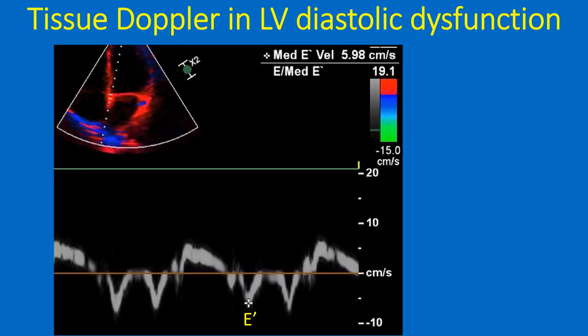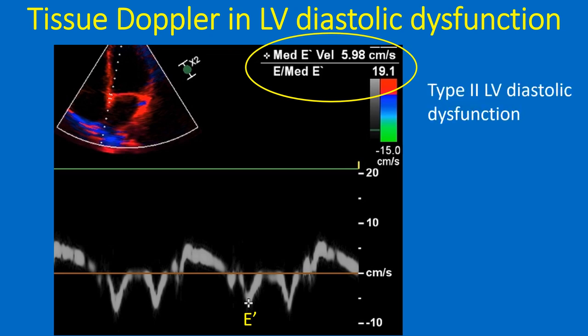Tissue Doppler imaging with colour kinesis is shown in the inset. The E-by-E prime of the medial mitral annulus is shown as 19.1, indicating type 2 left ventricular diastolic dysfunction. In diastolic dysfunction, as the relaxation of the ventricle is impaired, the velocity of the medial mitral annulus is reduced so that the E-by-E prime ratio is increased. The E-wave is measured prior to tissue Doppler imaging and stored so that the software displays the E-by-E prime ratio as soon as E prime is measured.